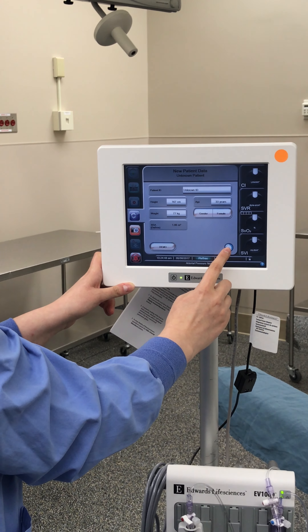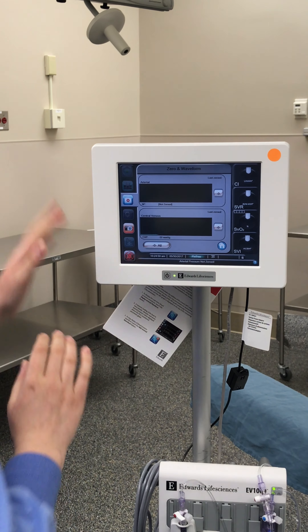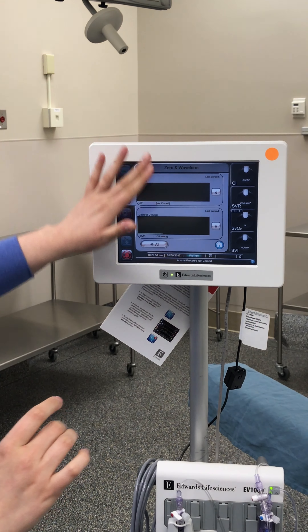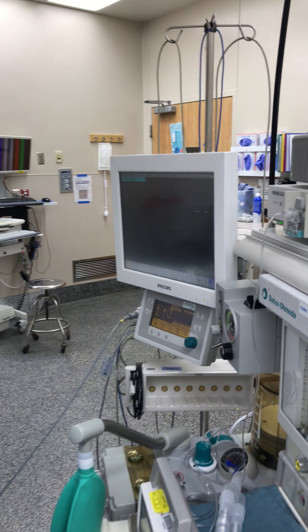Then we're going to hit this little home button here in the corner. It's going to come up with this screen — zero in waveform. So we need to zero our arterial line and our central line here, and we need to do it at the same time as we do on our Philips monitor for anesthesia.